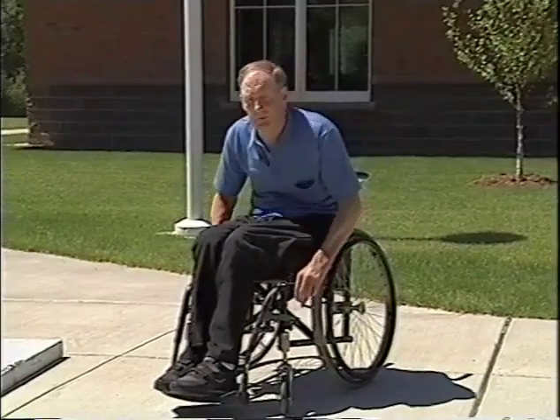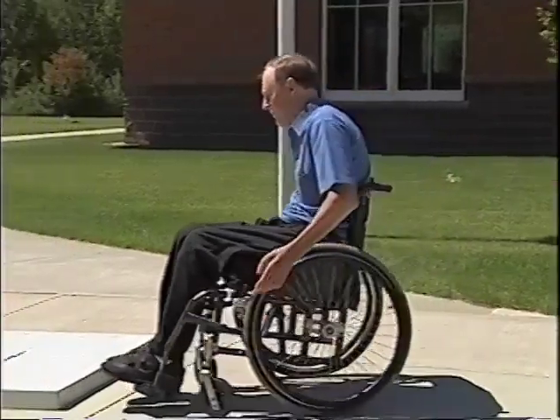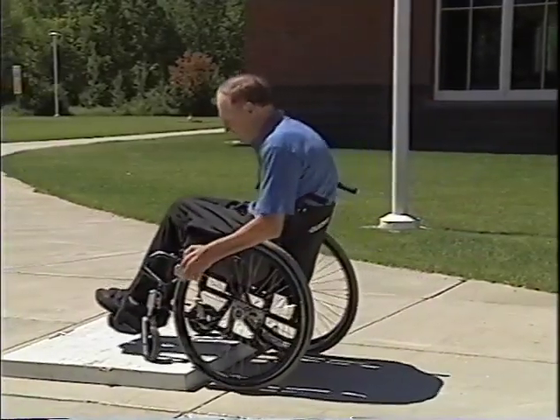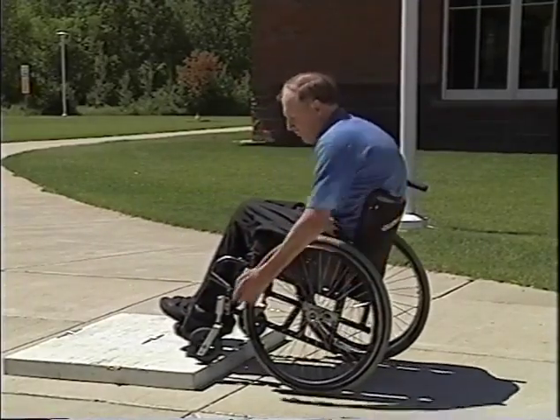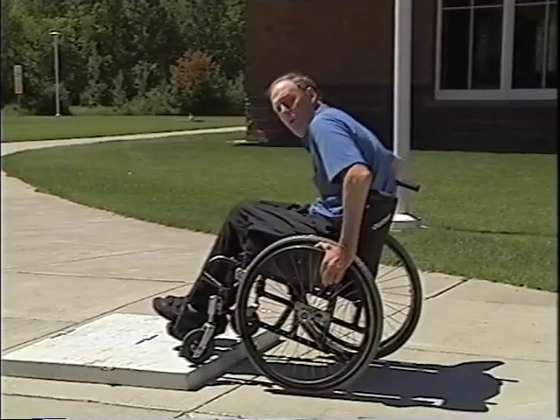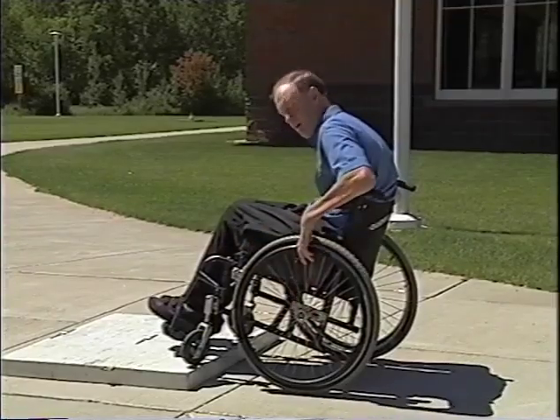Another method of teaching jumping up and down curbs, which I generally use for quadriplegics who don't have really great mobility yet or are using projections, is to teach them a two-step method, which is basically to pull up to the curb, then pull a wheelie and get their front end on the curb. Now here, you're going to back up, spin your front wheels around. It gives you more room, which will give you some running momentum before you hit this curb. And then you just simply need to either fall forward or put your weight forward before you push and have everything in front of the axle.